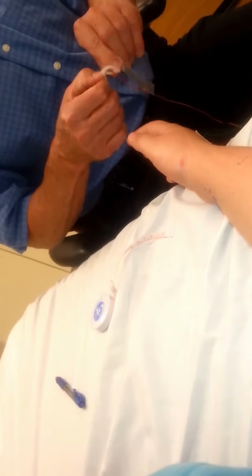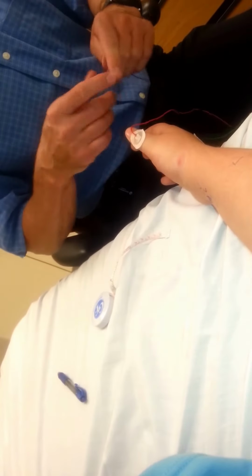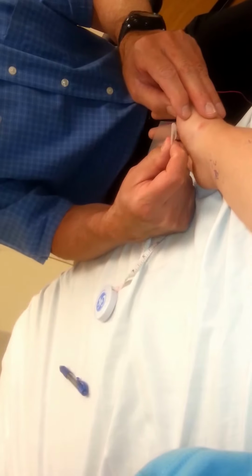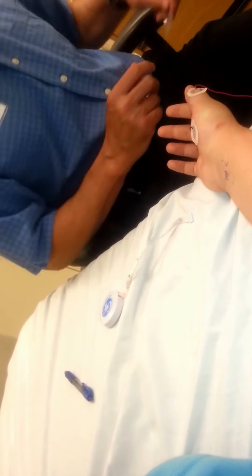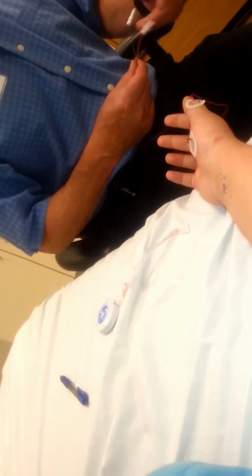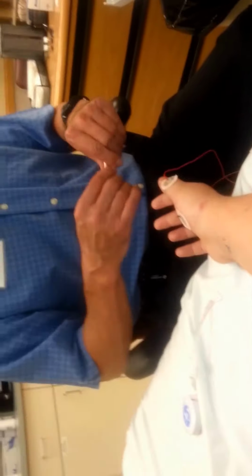Electrodes. These are recording electrodes. Ground on the back, a reference electrode, and this is the active recording electrode, and we're putting it over the abductor pollicis brevis muscle. And that, we're checking the median nerve conduction across the wrist.